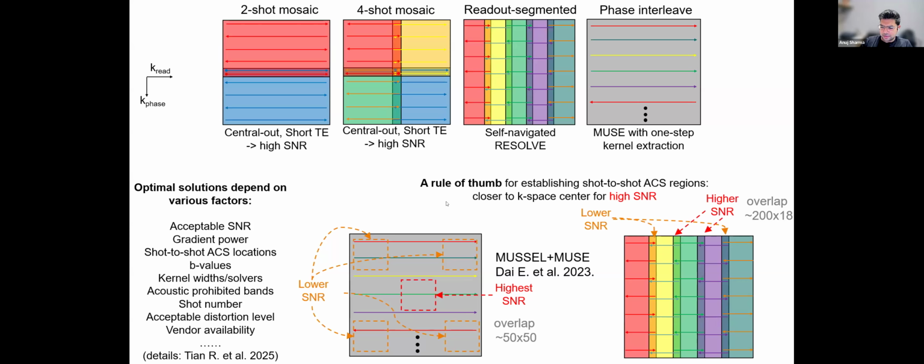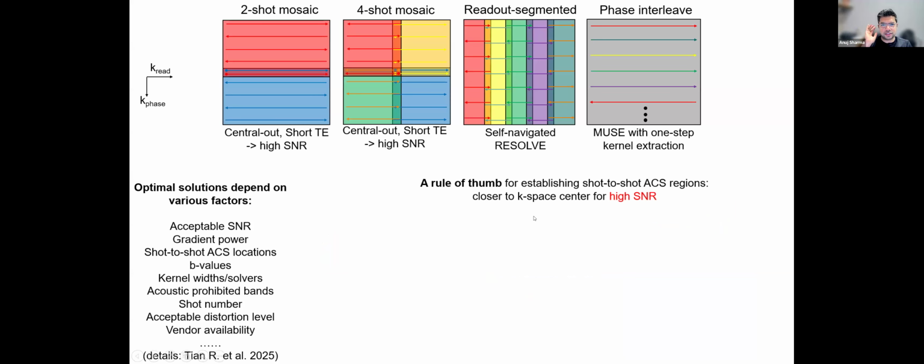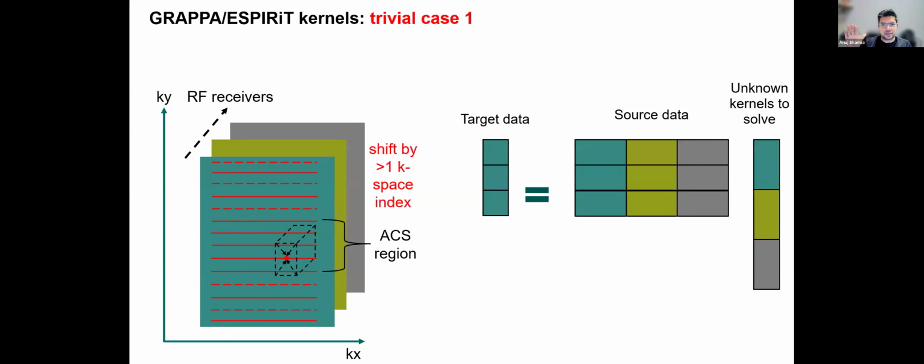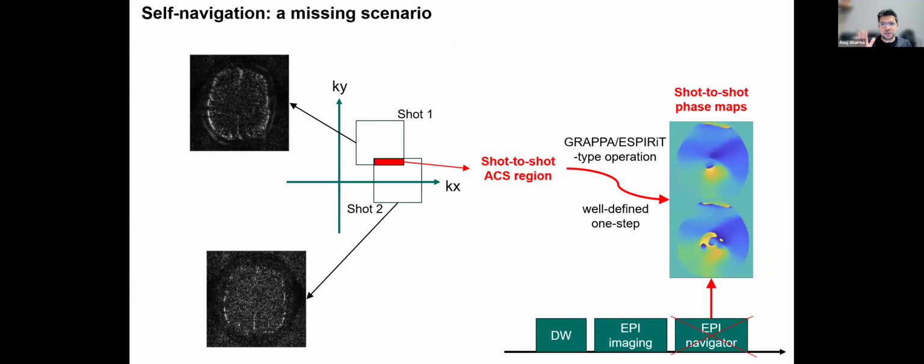So I worked on readout segmented EPI several years ago. I implemented it on Canon, and for phase correction, we used what Samantha Holdsworth described in a paper, using a 2D navigator acquired right after the imaging readout in each shot. It was still difficult to get phase correction right. Even with physiological motion in the brain, you will see high differences across the shots, and getting a good correction going was hard. So your work is really useful, really beneficial. Congrats on that, and thanks for the talk.